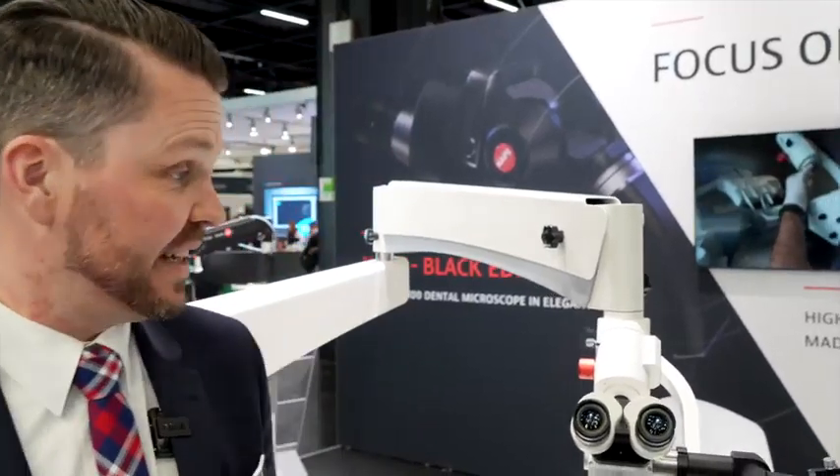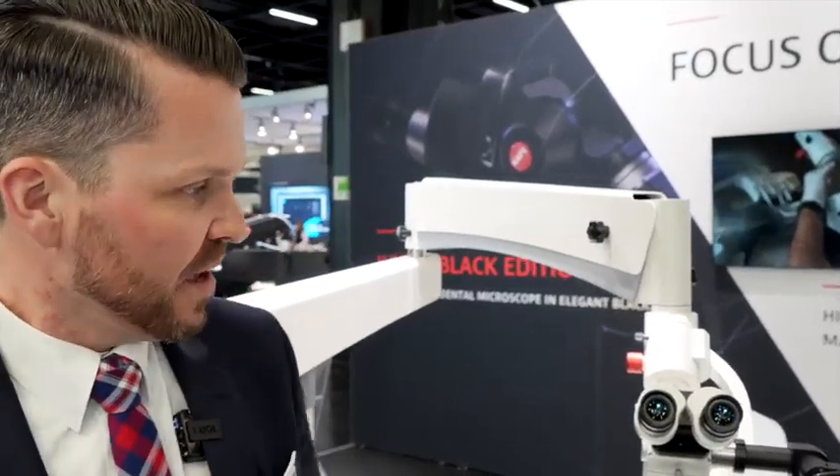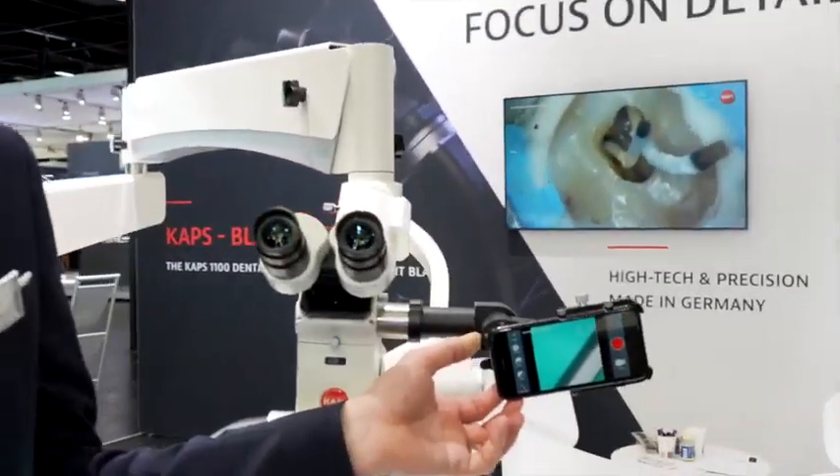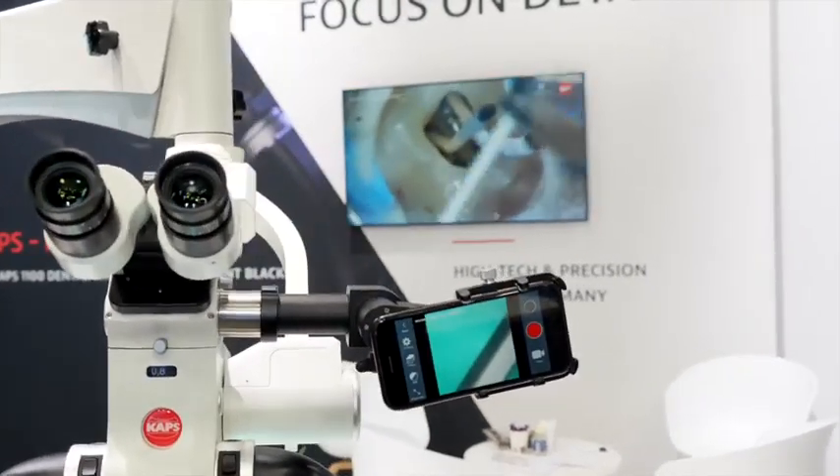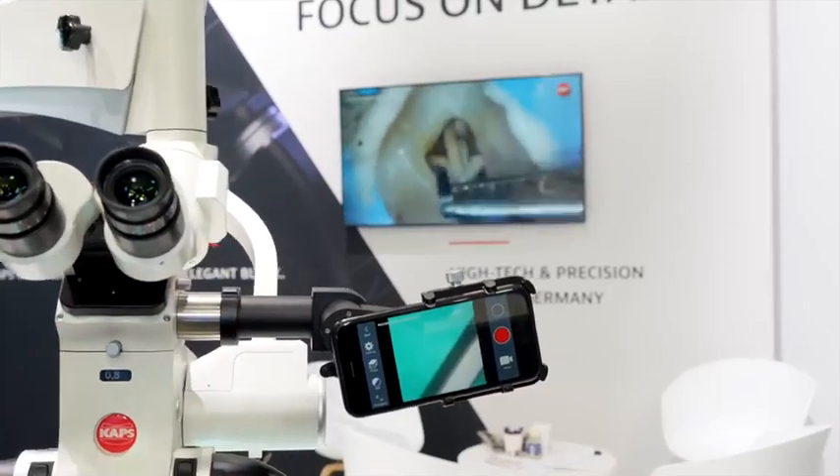Here are our news for the IDS 2023 in Cologne. We have our new smartphone adapter which is able to connect every common smartphone to our microscope line, even to the SM4Dent or the classic CAPS 900 to 1100 line.